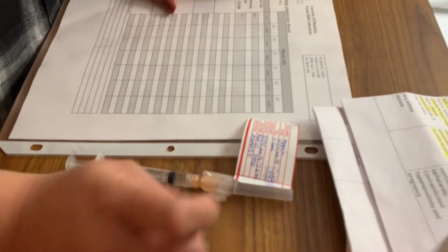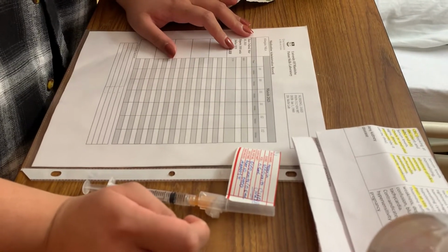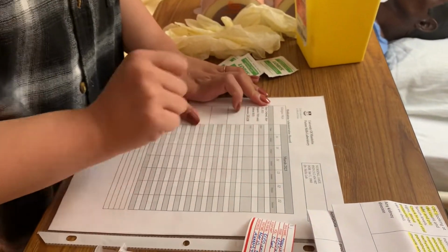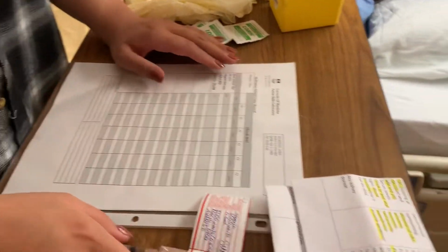Right route is subcutaneous, right time and frequency, twice a day, and the current time is 9 a.m., so I will be administering it at 9 a.m. Today is March 10. Perfect, that is my third check.